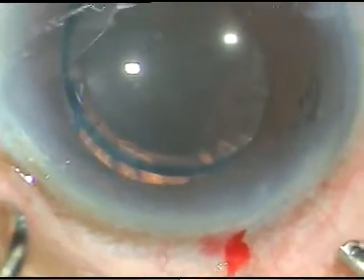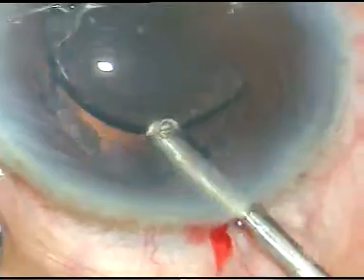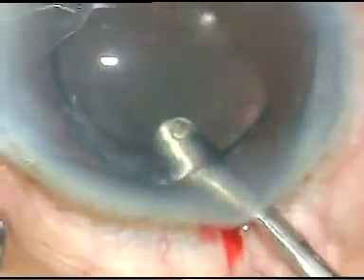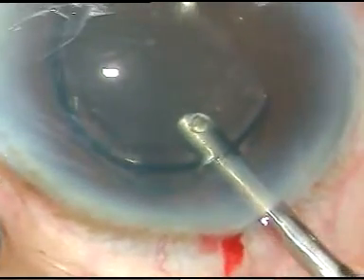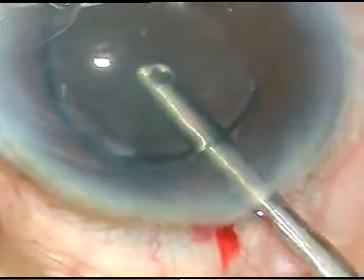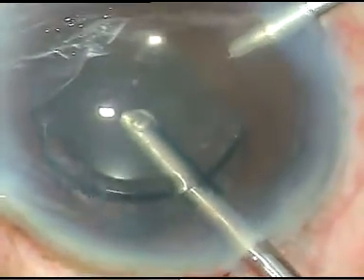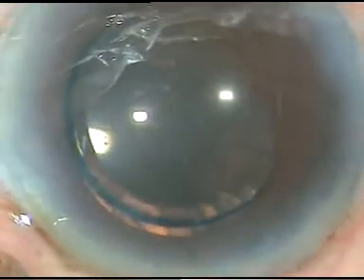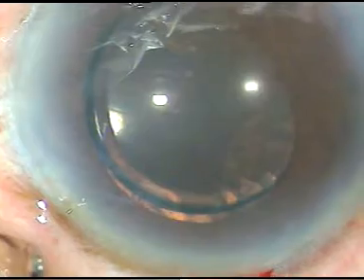Now the irrigation is through the 8 o'clock side port. The cutter is going through the main incision. The anterior chamber is nicely formed. And I am using the cutter to remove cortical lens matter as well as vitreous strands that have come through the rent.